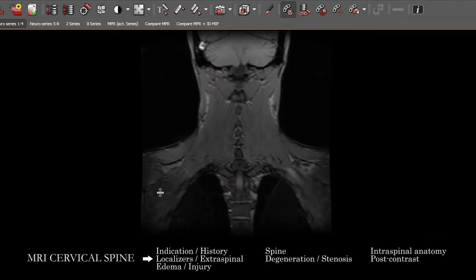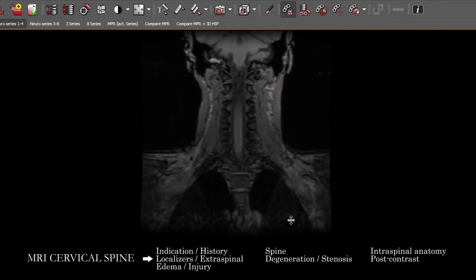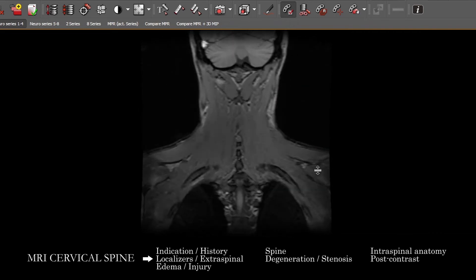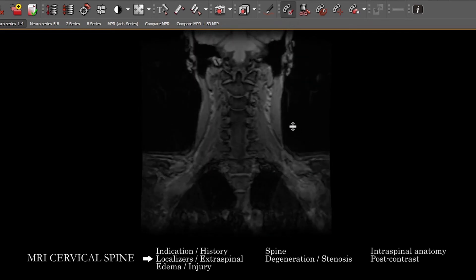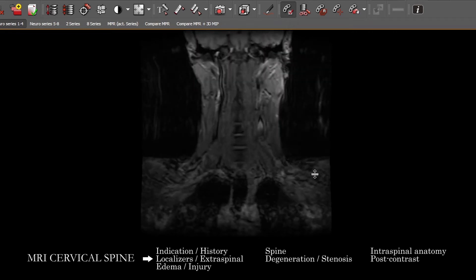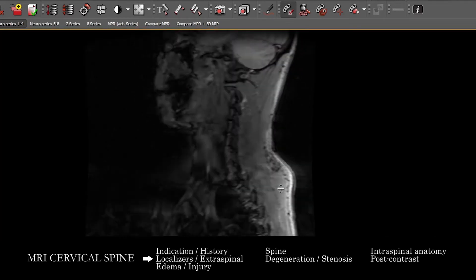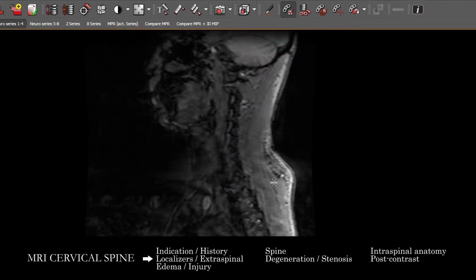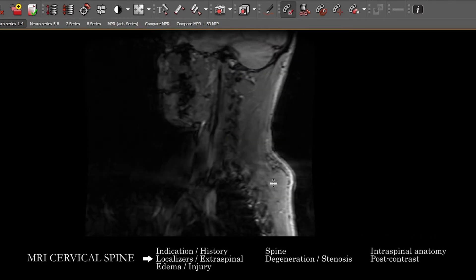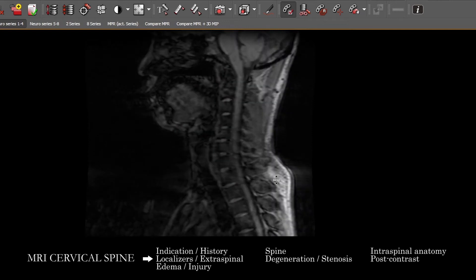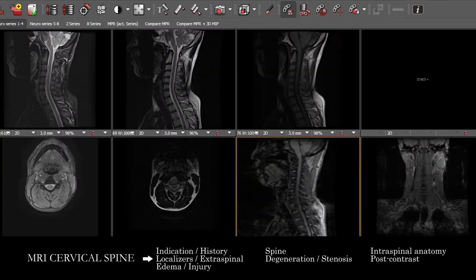You'll notice that there are parts of the upper chest, the lungs, mediastinum, and the shoulders that we're going to see on some of these localizer images. We just want to make sure that there are no incidentally seen mass lesions, especially at the edges and corners of these localizer images that we can go by quickly.